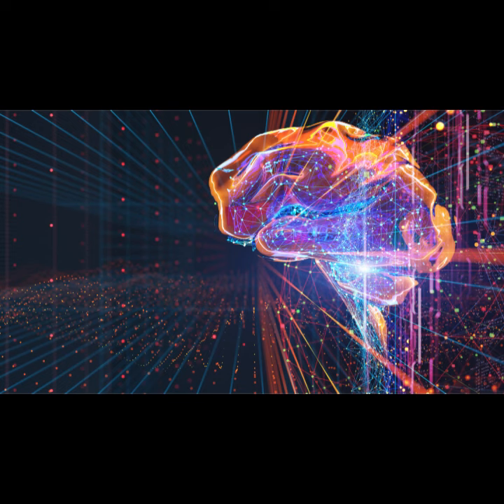Second, how do we navigate this K-space map? Well, it's all about physics. We use magnetic field gradients, turning them on and off over time. See, applying a gradient nudges the local magnetic field, making protons spin at slightly different speeds. The scanner measures these speed changes, and that tells it exactly where it is in K-space. It's like a super carefully timed dance to collect all that data.